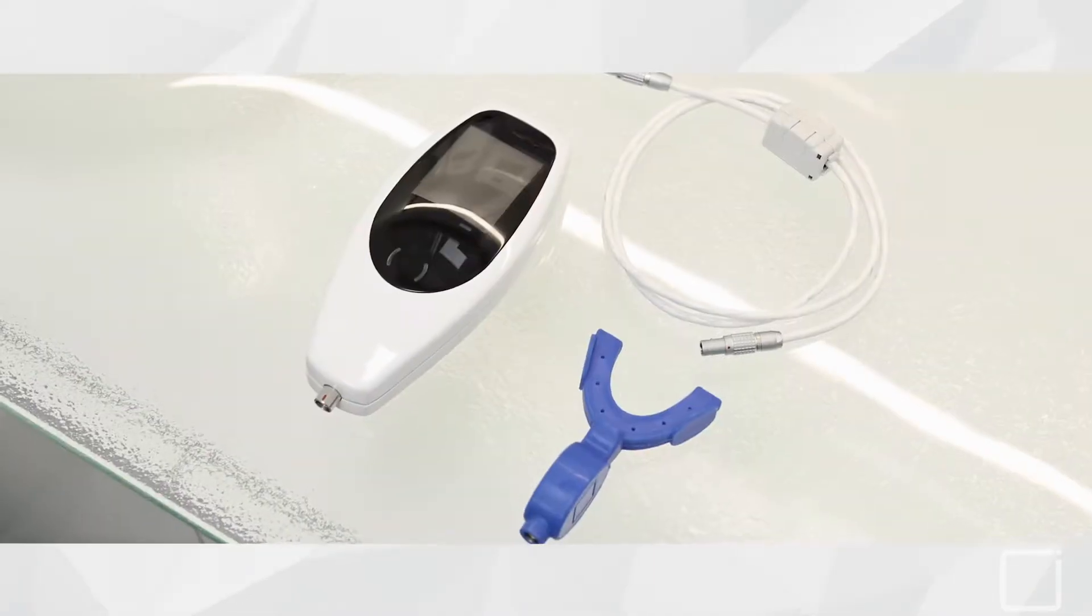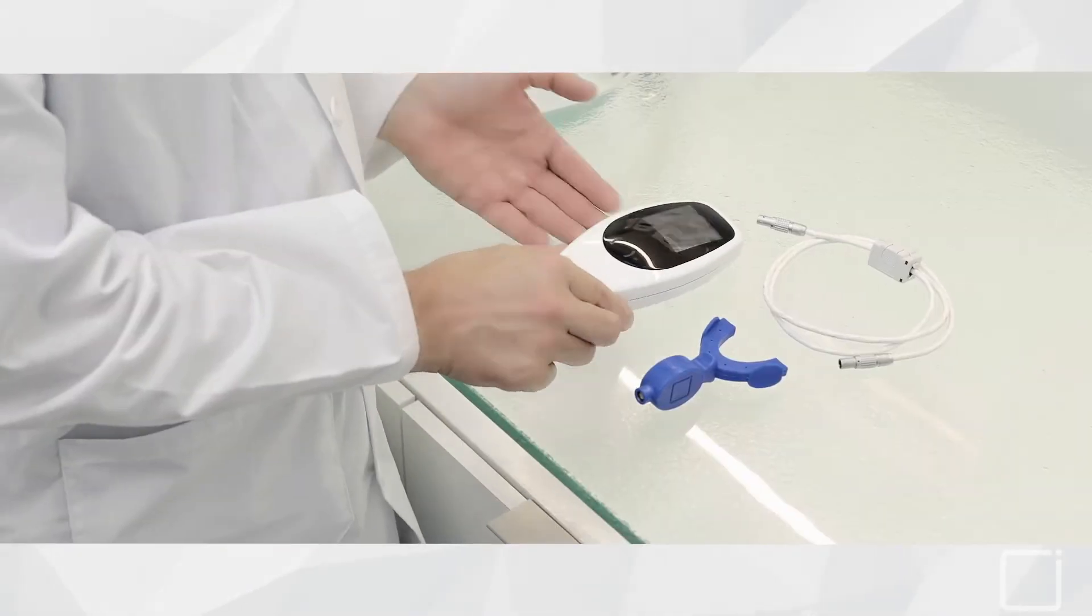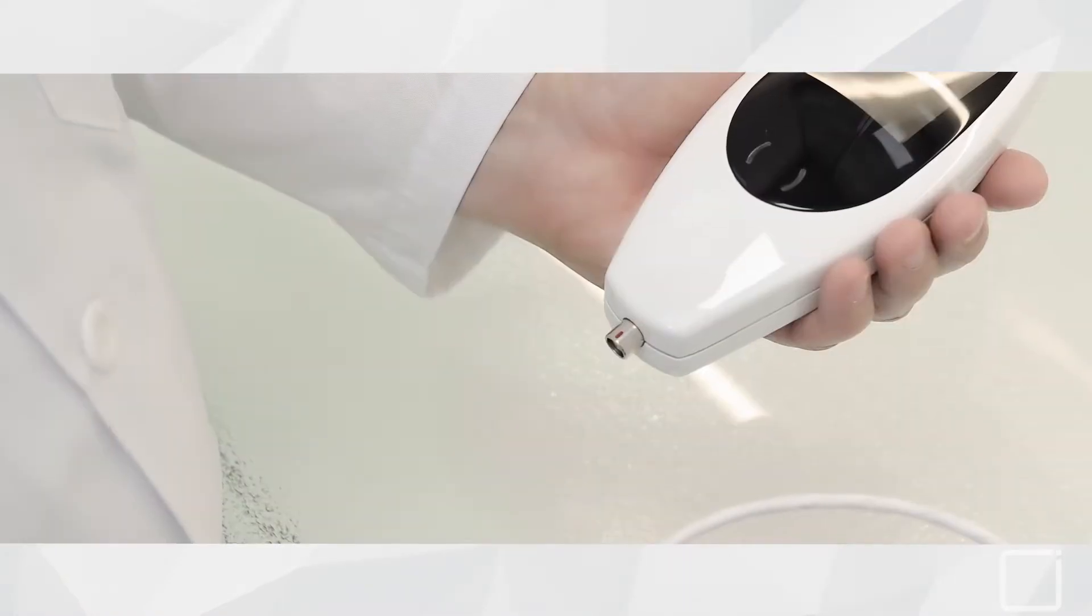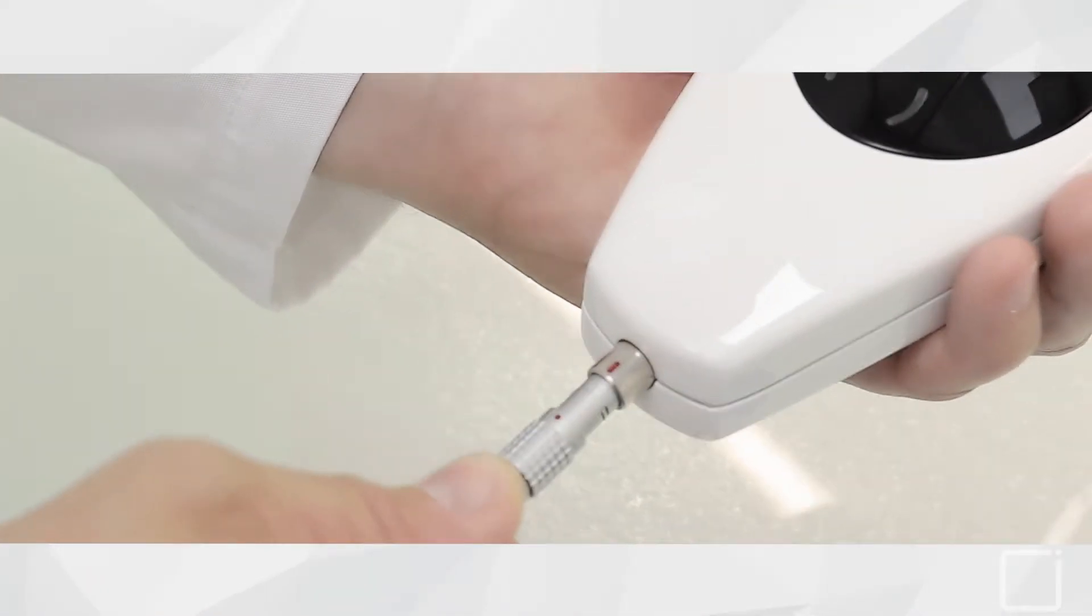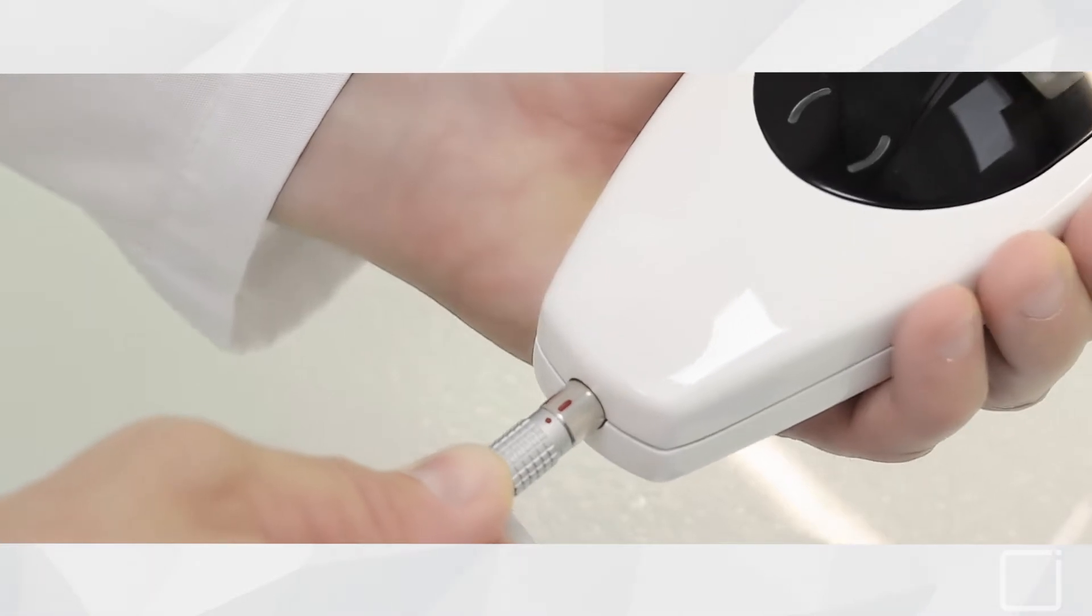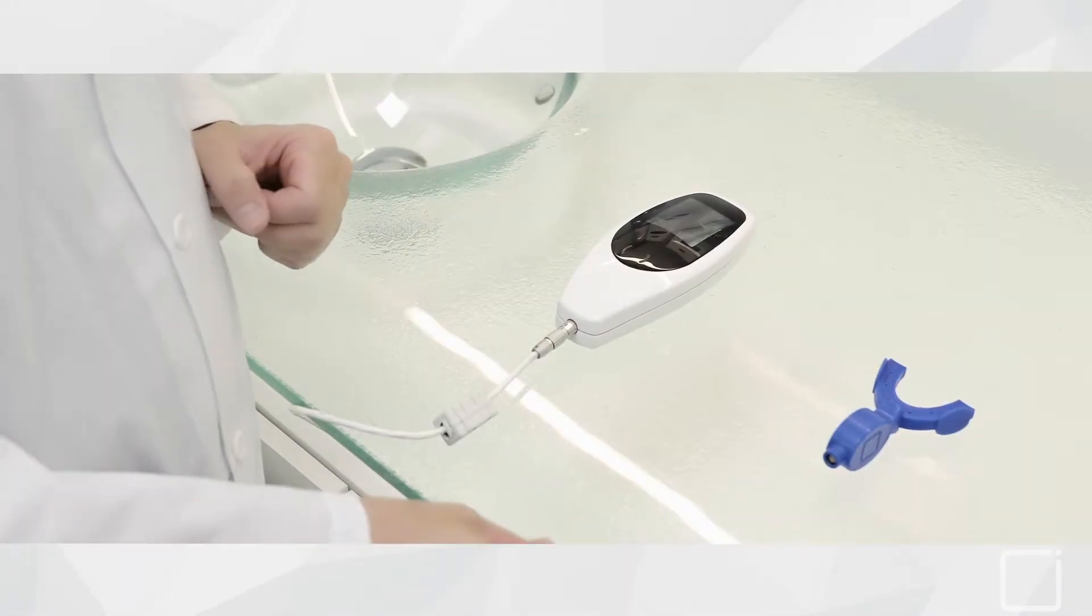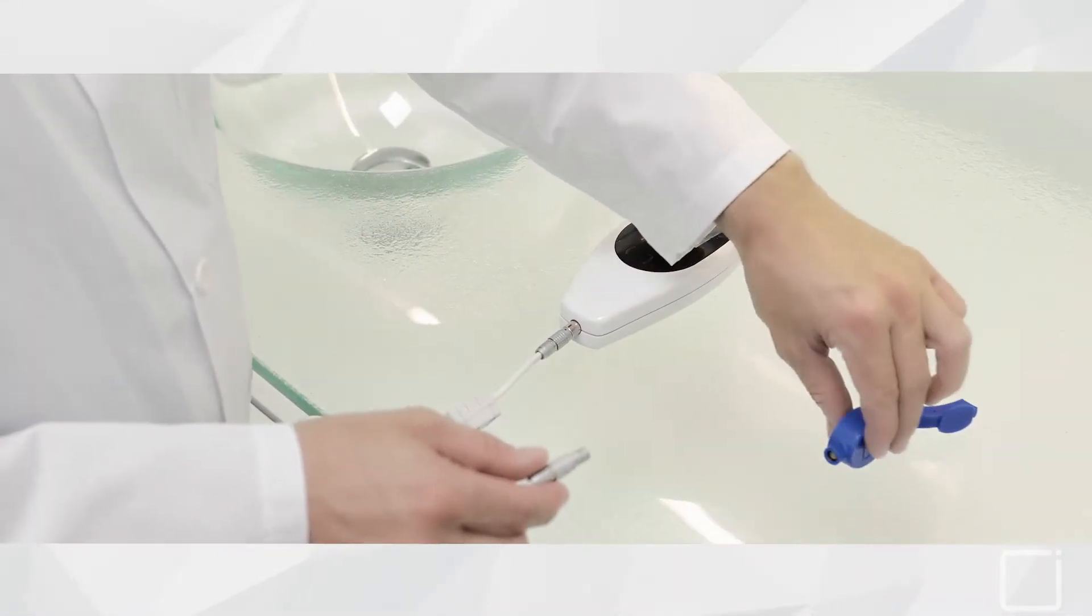The connection cable serves to connect the mouthpiece to the casing. On the handheld device, you will find a red dot indicating the precise positioning for insertion of the cable. The opposite end of the cable needs to be inserted into the mouthpiece connector.